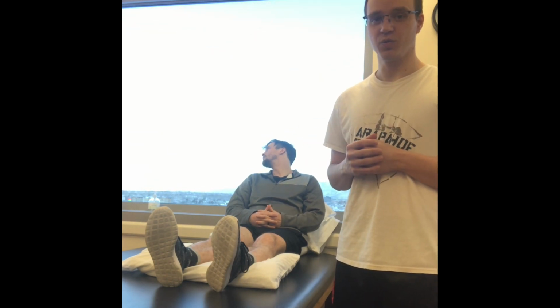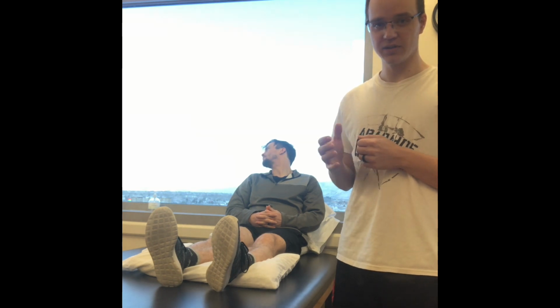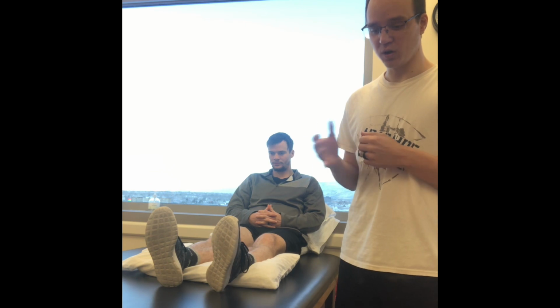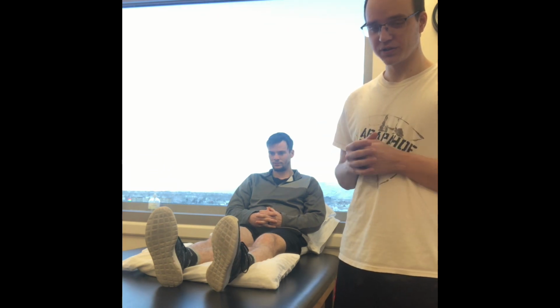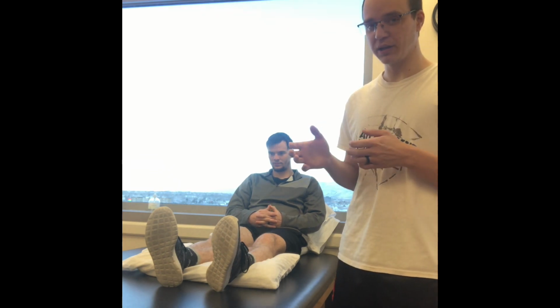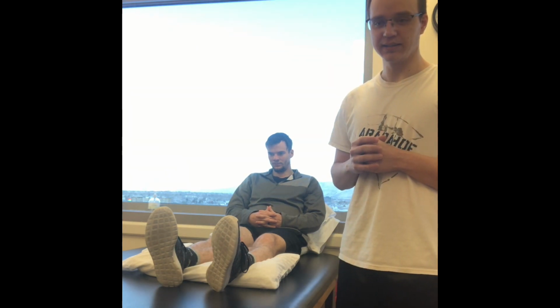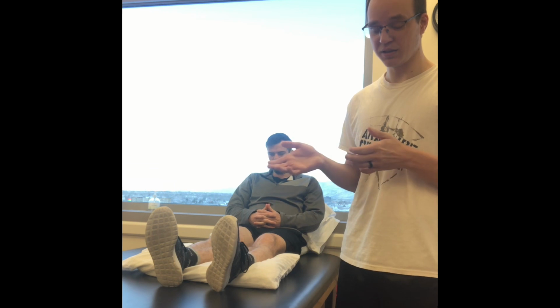So there are some good reasons or indications for why we would want to use biphasic treatment or electrical stimulation. One, for just electrical stimulation, is it's good for pain modulation. Our patient here today is 2 weeks post-op on an ACL reconstruction, and he's in the proliferative phase of healing. Thankfully, his pain has gone down quite a bit, so we're not going to really be using it for pain modulation since it's already well controlled.